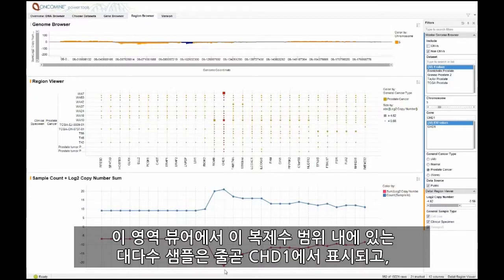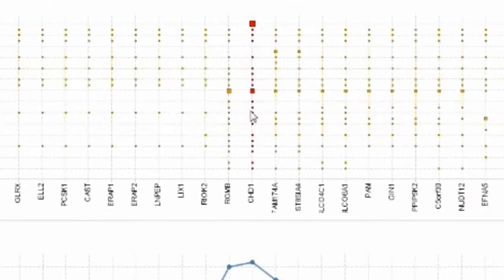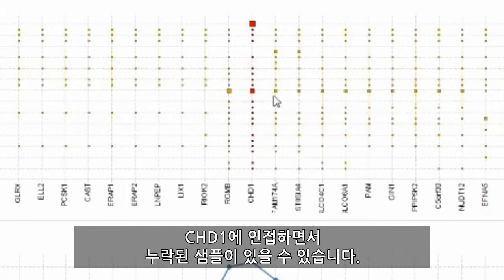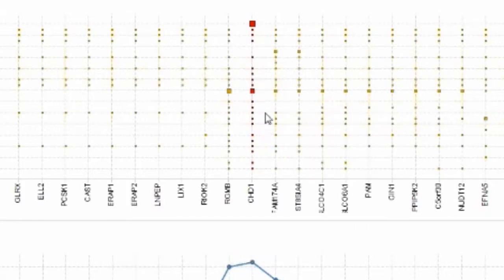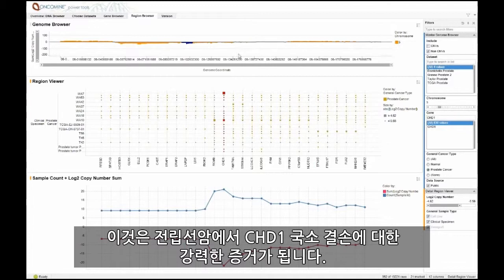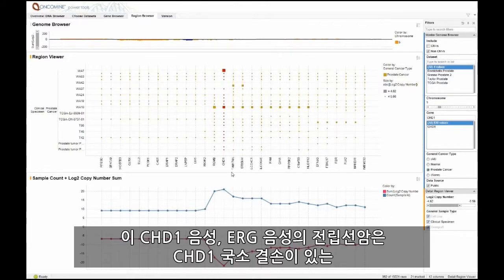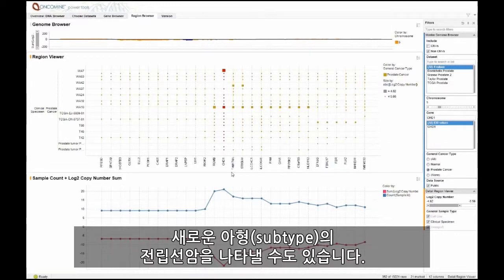In our region viewer, we can see that the majority of samples within this copy number range are represented all the way across CHD1, where there may be missing samples flanking CHD1 on either side. This provides strong evidence for CHD1 focal deletion in prostate cancers. These CHD1-negative ERG-negative prostate cancers may represent a new subtype of prostate cancer that have focal deletions of CHD1.